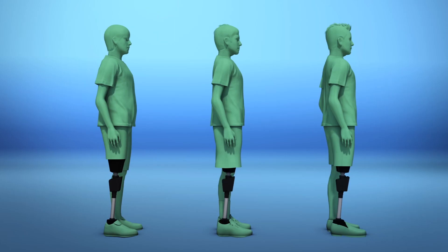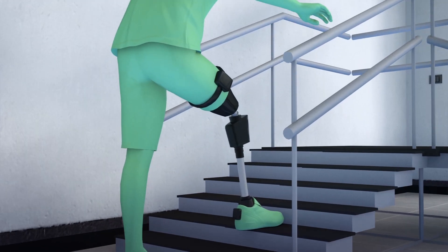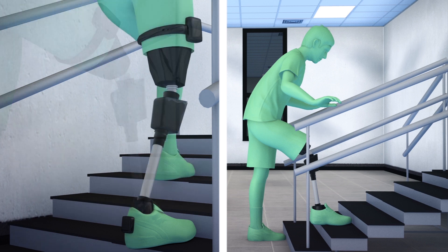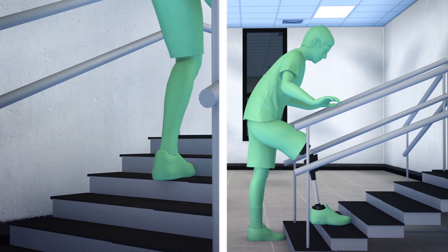The sensorized prosthetic was tested on three different amputees as they conducted different activities, such as walking up and down the stairs with and without the neuroprosthesis. The study found that the sensorized bionic prosthetic allowed the participants to successfully feel obstacles underneath their foot, prevented them from falling, and allowed them to walk faster.